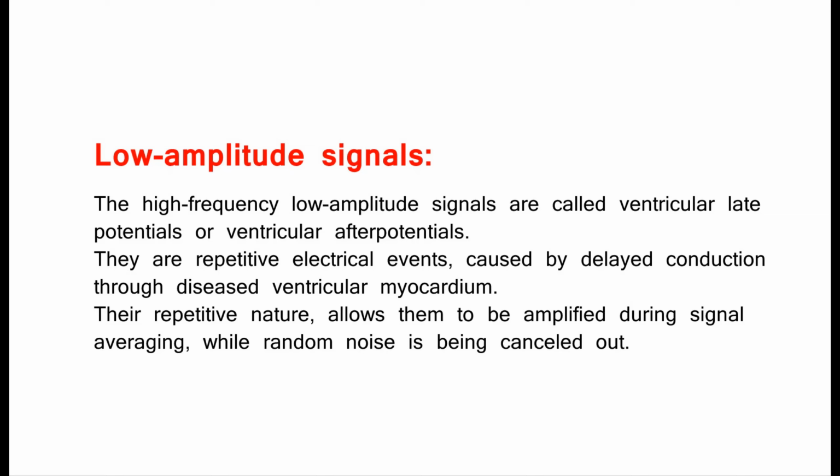Low-amplitude signals. The high-frequency low-amplitude signals are called ventricular late potentials or ventricular after potentials. They are repetitive electrical events, caused by delayed conduction through diseased ventricular myocardium. Their repetitive nature allows them to be amplified during signal averaging, while random noise is being cancelled out.